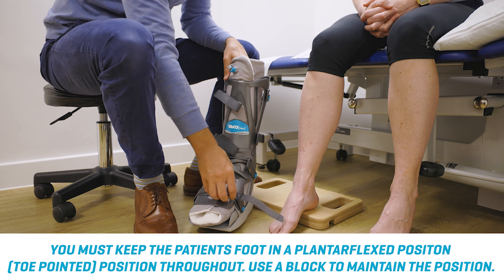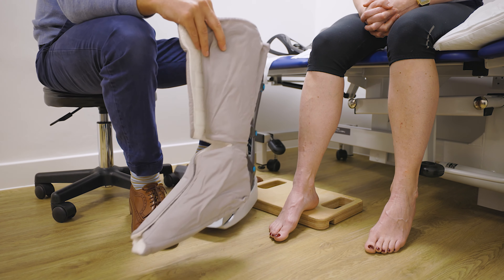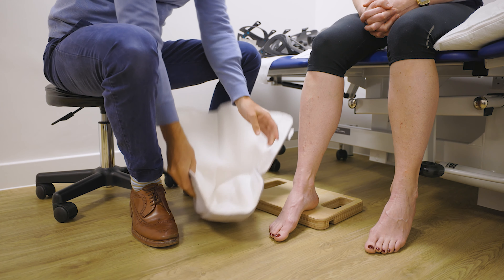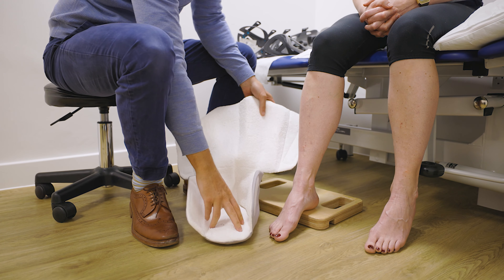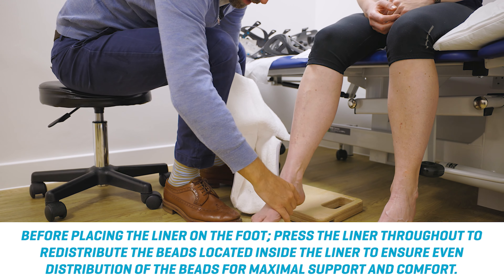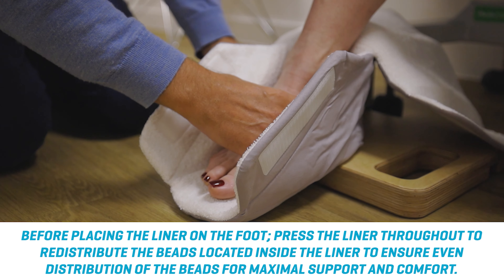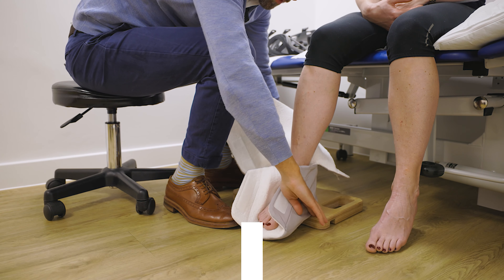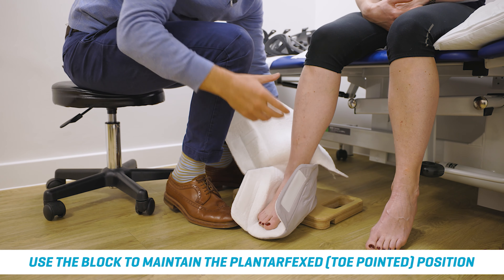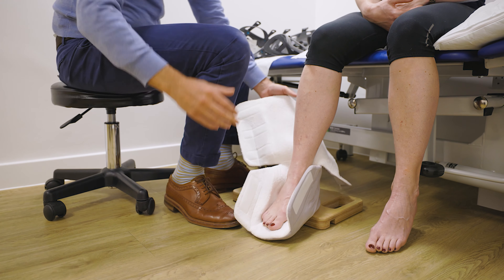If we take the straps off, then we can pull out the superior skeleton, and obviously we can get rid of the inferior skeleton. What we're left with is this rather comfortable looking fabric for your feet — make sure it's nice and smooth everywhere. We don't want to lose the plantar flexed position, so keep that position, straighten your knee, and just ask the person to push back into the back of the fabric. You could use a book or a yoga block to make sure that heel is higher than the forefoot. Push that right the way back in.